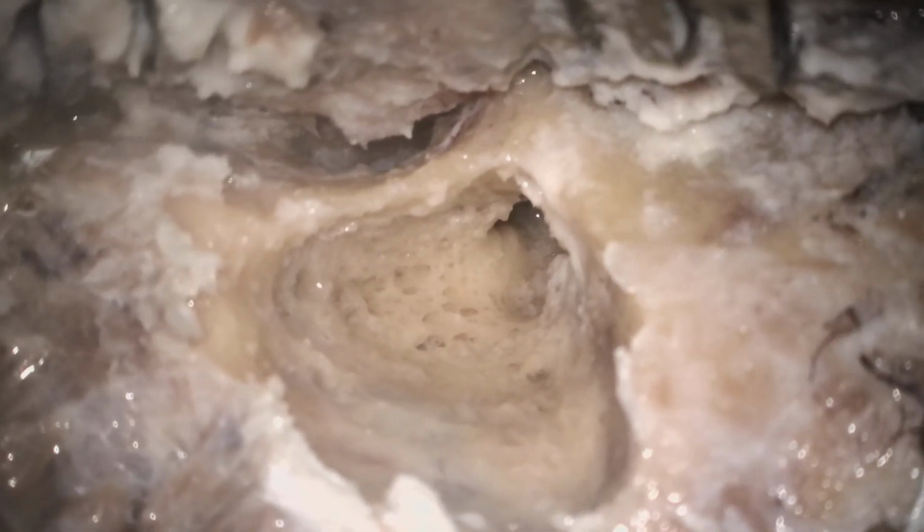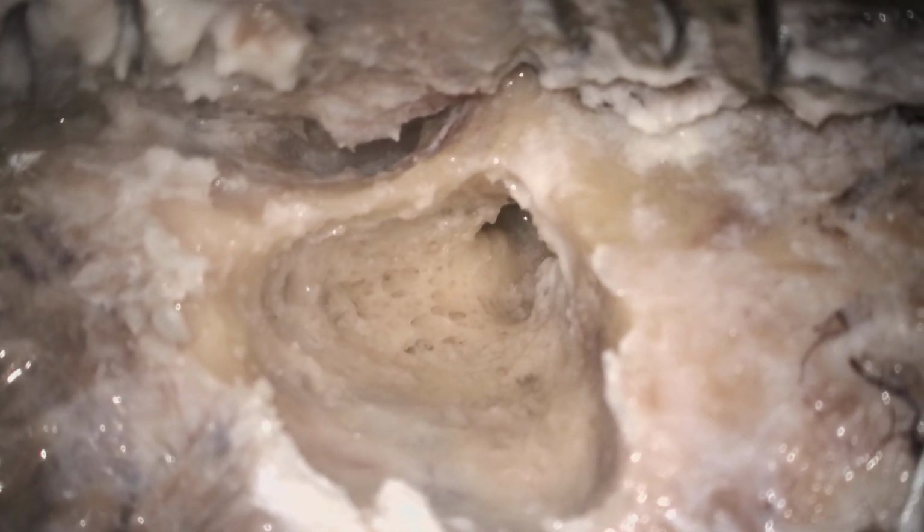Yes, actually the talkback might have some problem. That's why there is a frequent disconnection. Yes, in case of normal day-to-day surgery, look, the color of the otic capsule bone and the surrounding bone is different. Okay, so the density.